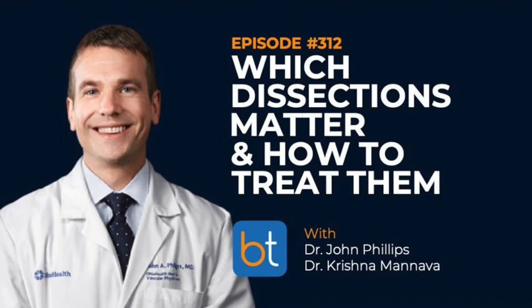If there is a dissection below the knee in the tibial vessels, depending on where it's located, I'll put a coronary stent in as well, but I try to limit the lengths of those, and I try to keep it in the upper third of those tibial branches.